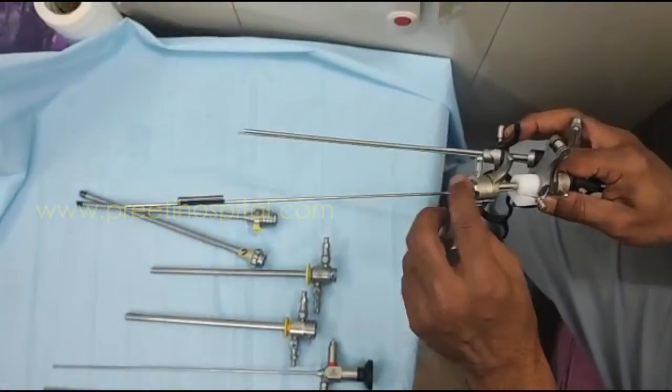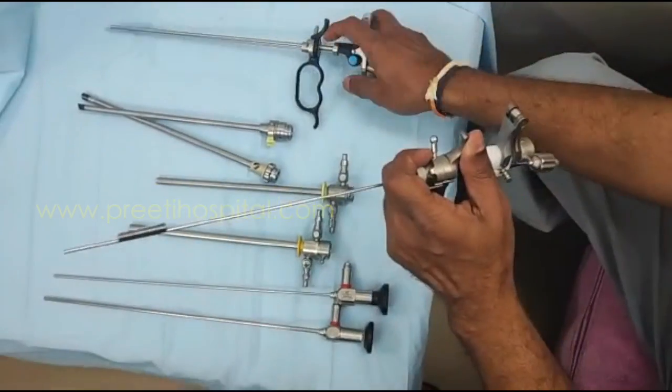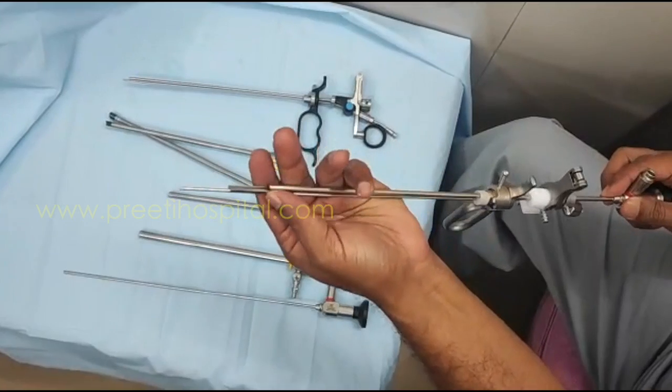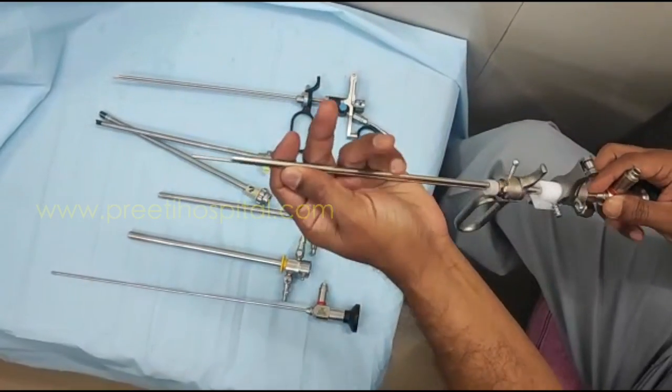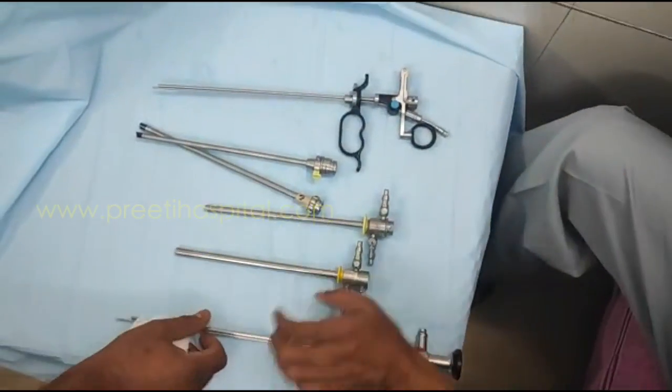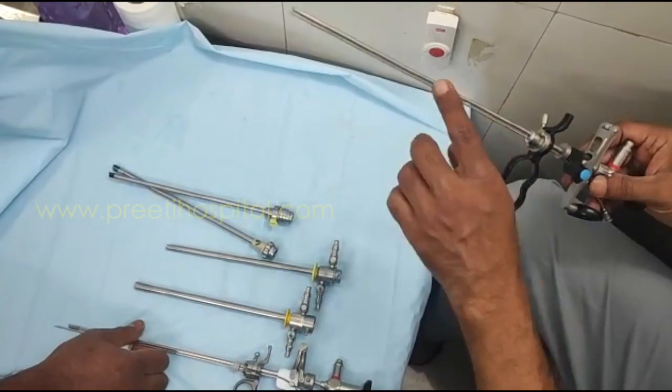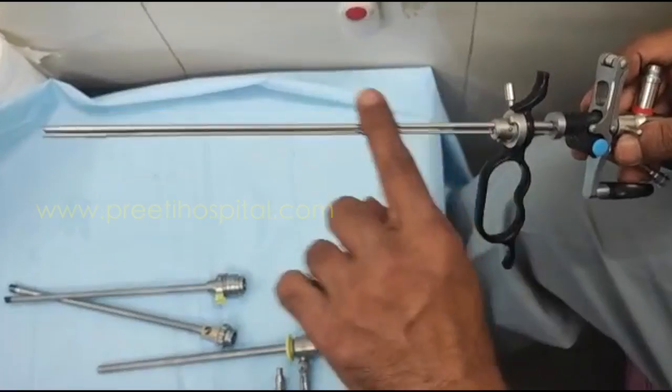Whereas there is no telescopic lock here — you directly put it in and it goes all the way. You have to engage here. Whereas in this one, it goes here and will directly go in and come out. This is very useful because there will be no movement inside.